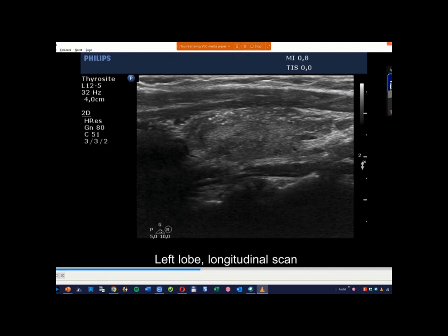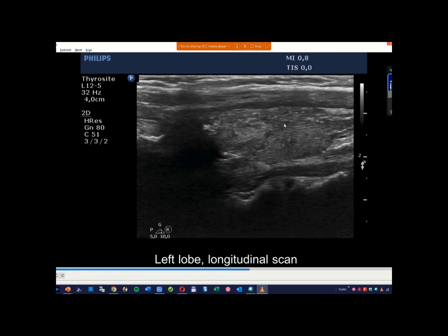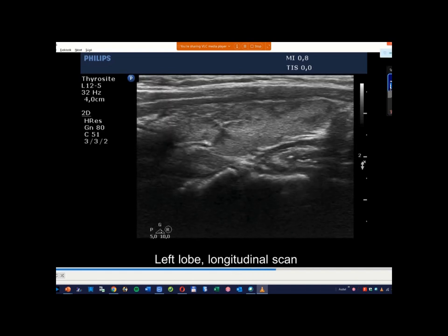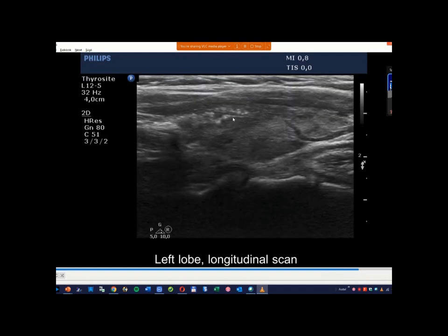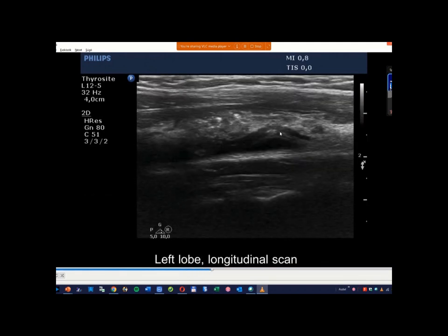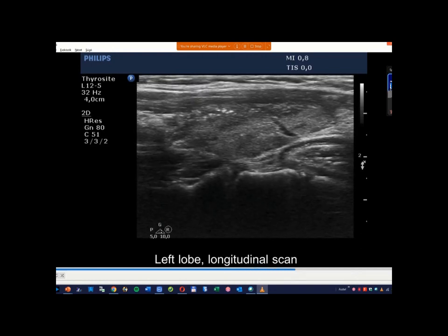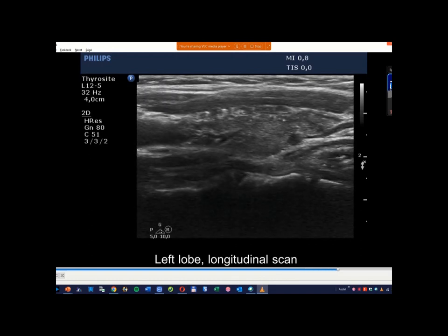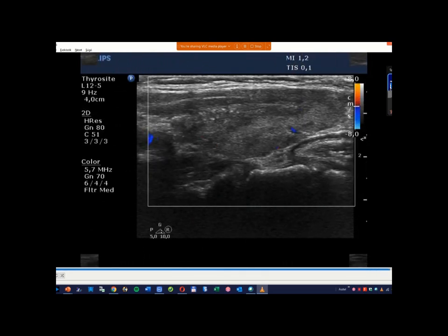I saw a very small number of suspicious signs. My final diagnosis was mainly based on this ultrasound pattern. And you sent this patient twice to me before the surgery, after the delivery, I guess 9 months after, and the pattern was the same. So maybe the cytological pattern was influenced by the pregnancy, but not the ultrasound pattern. And this pattern was so alarming that I suggested surgery. And maybe if I met another patient with a similar pattern, I would make the same mistake. So it is very, very difficult not to be concerned facing this pattern.